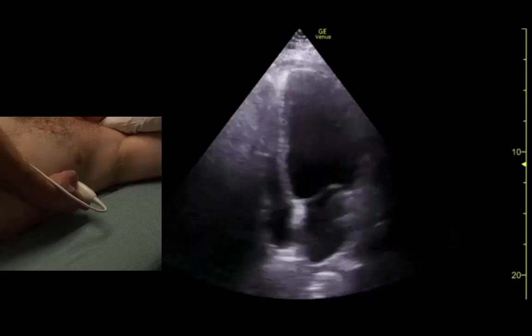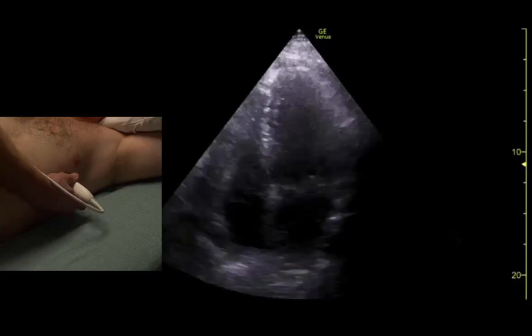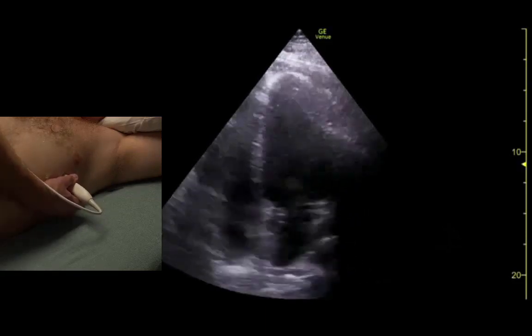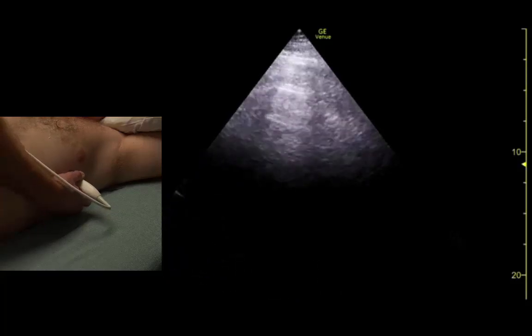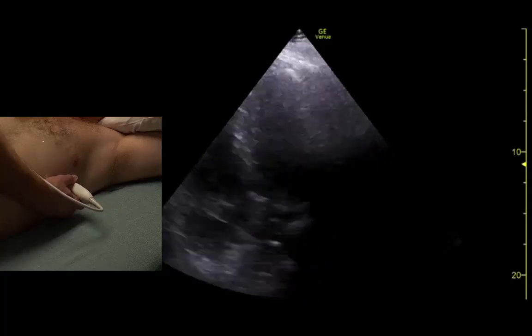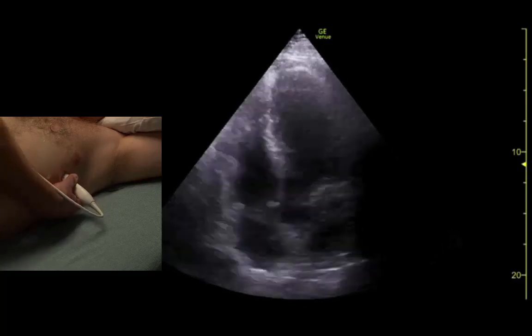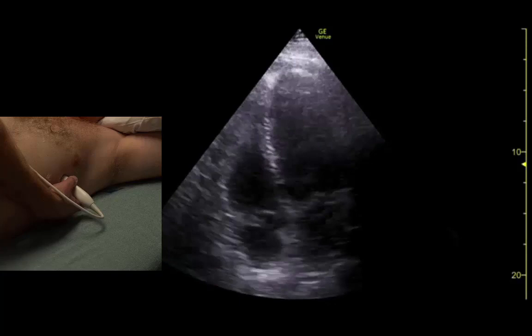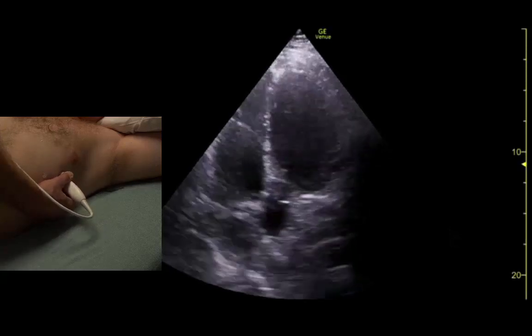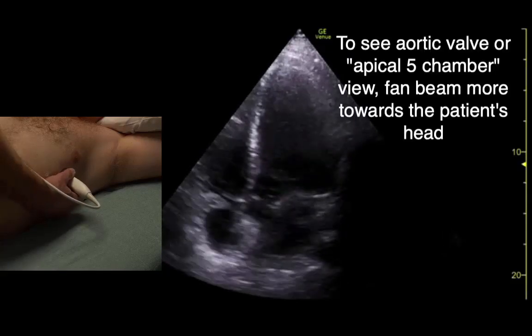If the image looks like the right ventricle is flattened, we need to rotate clockwise a little bit. Sometimes we may also want to see the aortic valve, so we'll just adjust slightly to bring that into view.